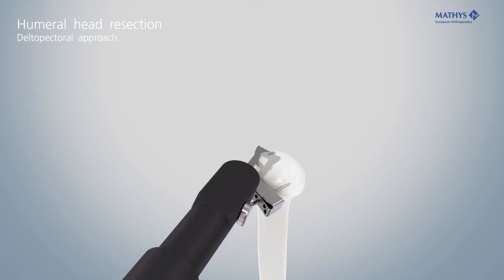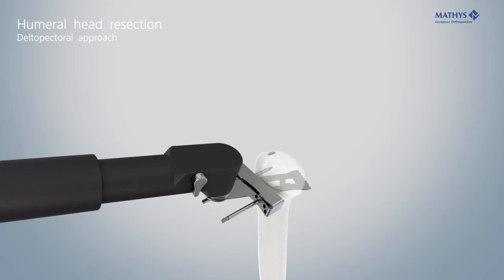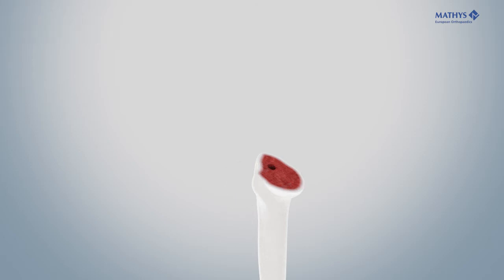If additional resection is necessary, transfer the cutting block into the pins via the proximal holes and saw again. Remove all instruments and check the height of the humeral cut.